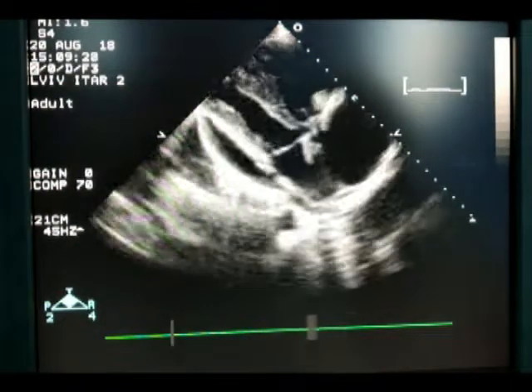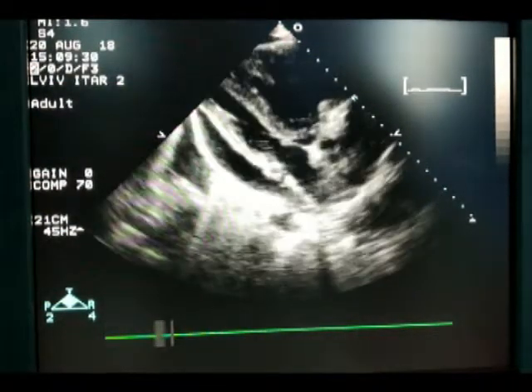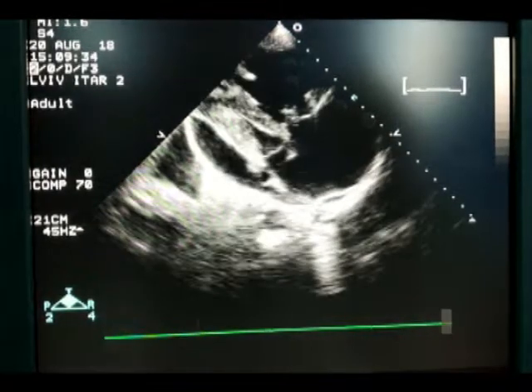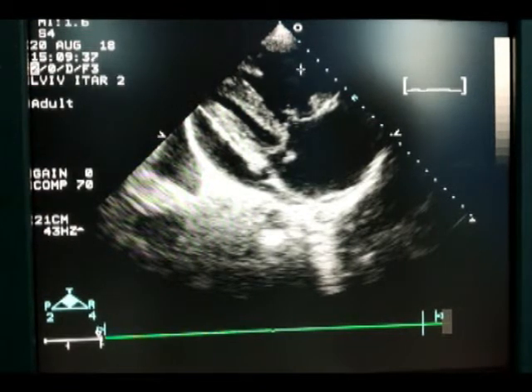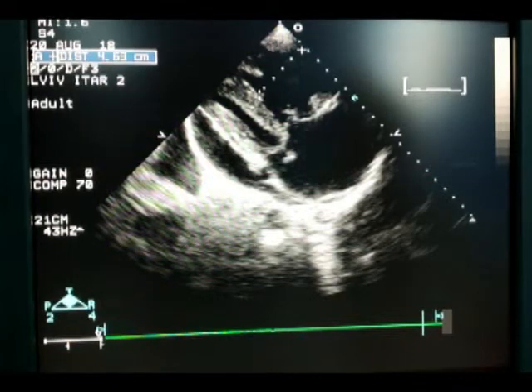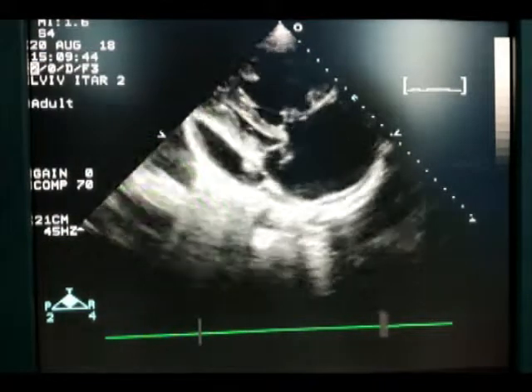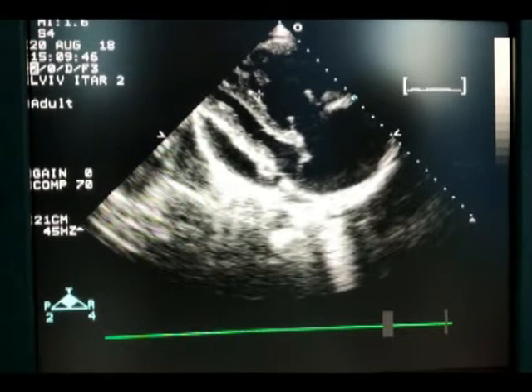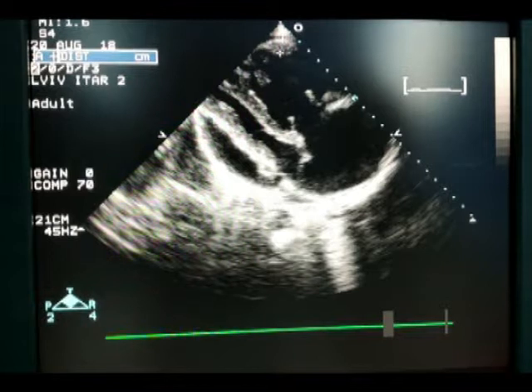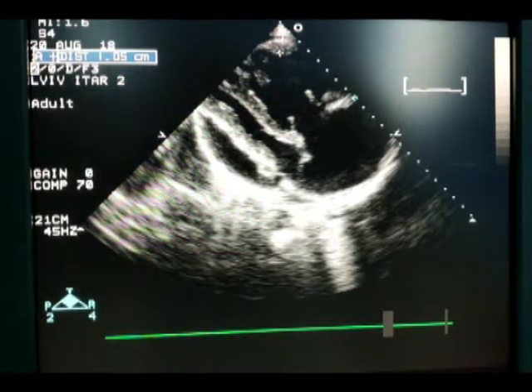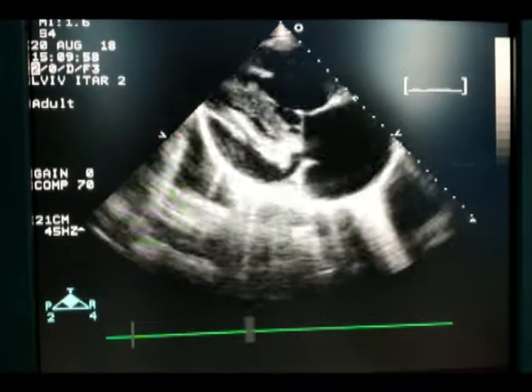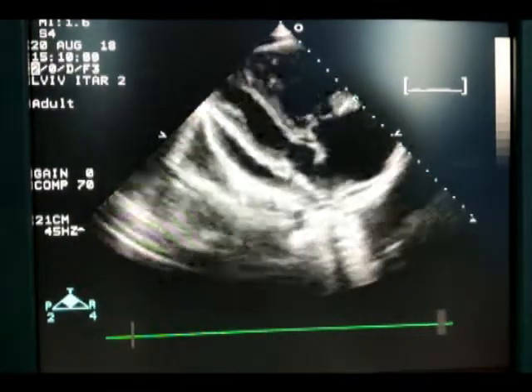The right ventricle is significantly dilated at 4.6 cm. Please note that the right ventricular wall is significantly hypertrophied — we can see this in cases of severe pulmonary hypertension. The thickness of the right ventricular wall is 1 cm. We can measure this parameter so clearly because this patient also has fluid in the pericardial cavity.